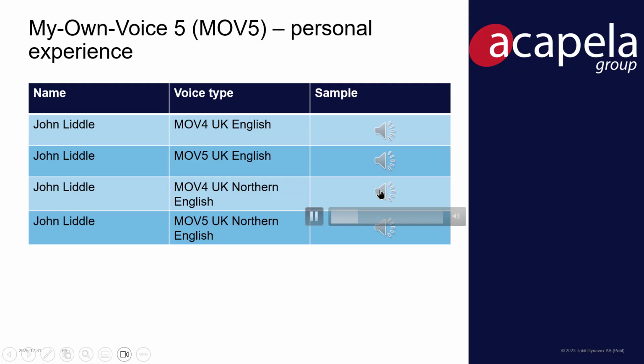He took a fast bus to go home and have a bath after slipping on the grass. My Own Voice for Northern English.